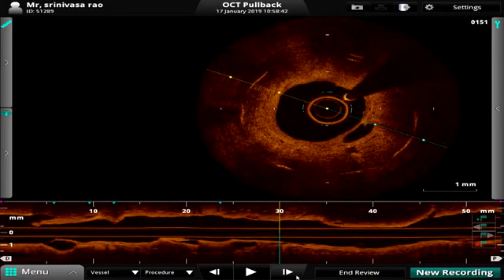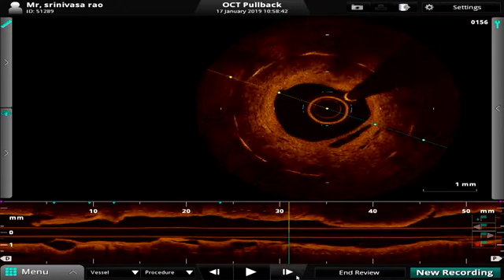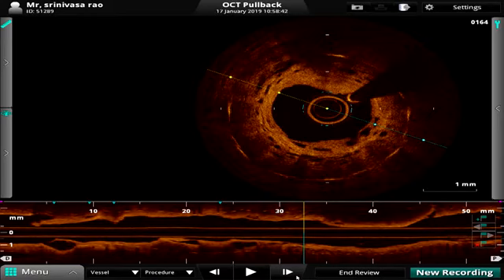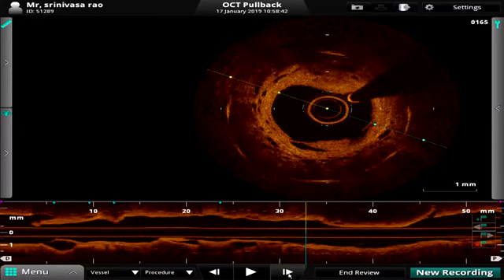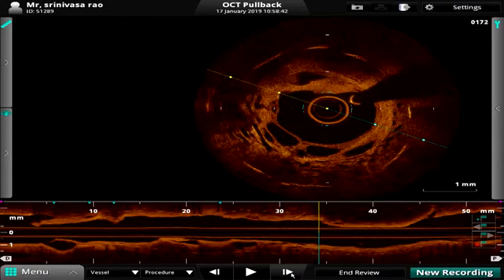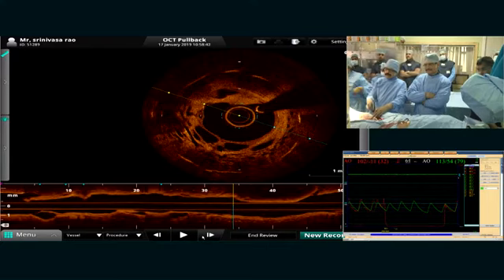There are three types of pathological findings in ISR CTO by OCT. The first is neo-intimal hyperplasia, which is a uniform hyperintense signal, a smooth muscle proliferative tissue. The second variety is a heterogeneous signal intensity, an admixture of lipid pool signals as well as neo-intimal hyperplasia. These were beautifully demonstrated in this present case on OCT. Then the next steps will be taken care of by... Actually, the distal dissection on the OCT in the PD has been covered with a 2.5 stent.